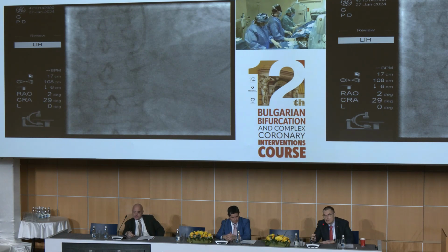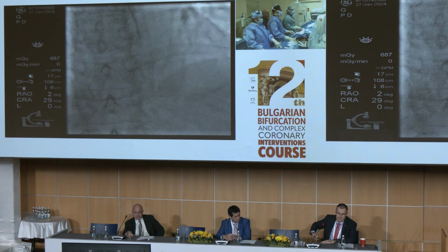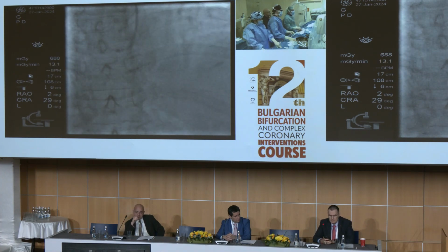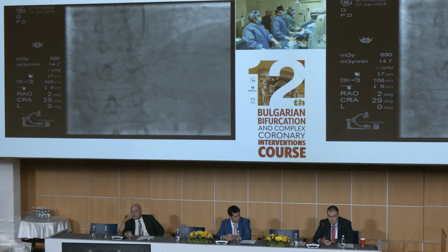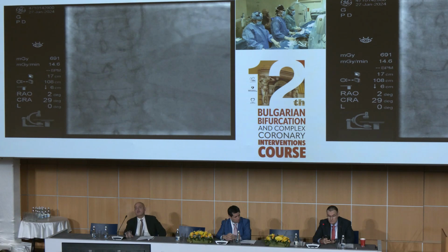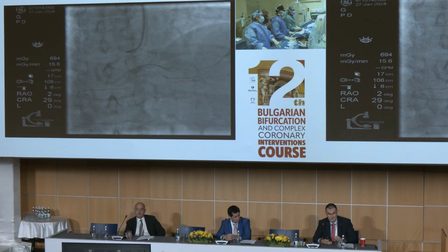The right coronary practically at the moment is fixed, and there was a stent previously, an Orsiro 3.0 in the middle segment, and there was a tight, subocclusive stenosis at the outflow and inflow of the stent. The stent was widely patent anyway.